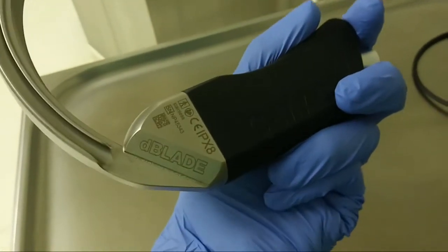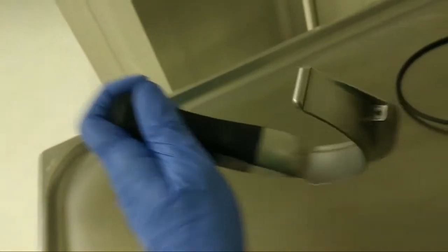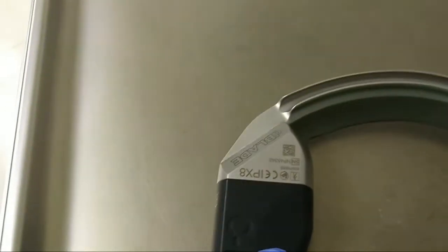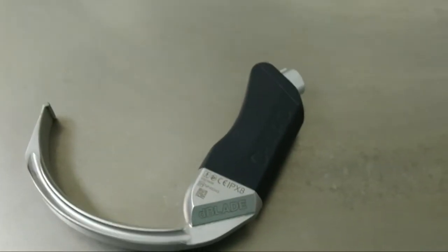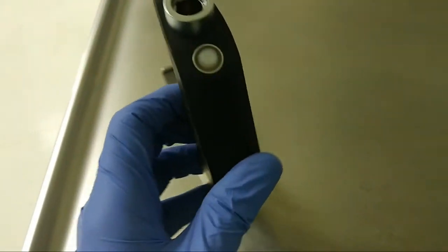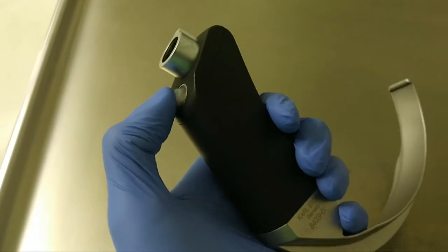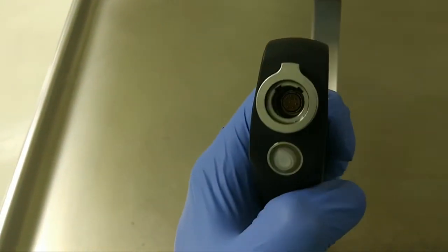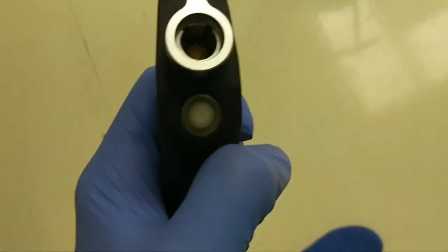It is also used laterally. It is also used for difficult intubation, cervical disc prolapse, and cervical surgeries, where we should restrict neck movements. Chin lift and head tilt, that much neck movement we can avoid with this equipment. There is one switch. With just a click we can capture photos, and with a long press we can capture videos.